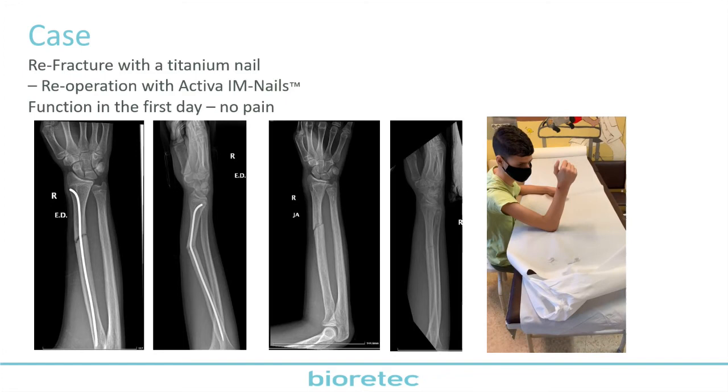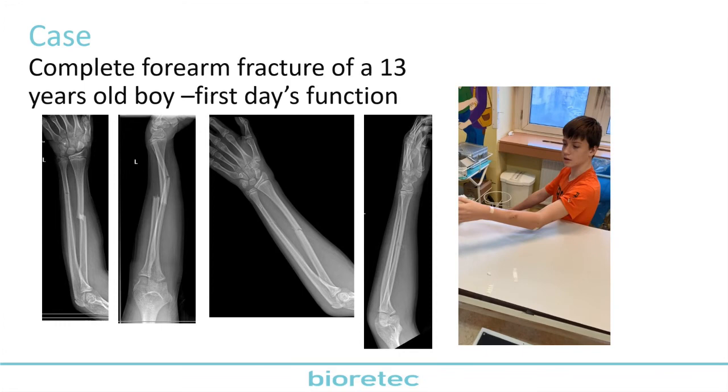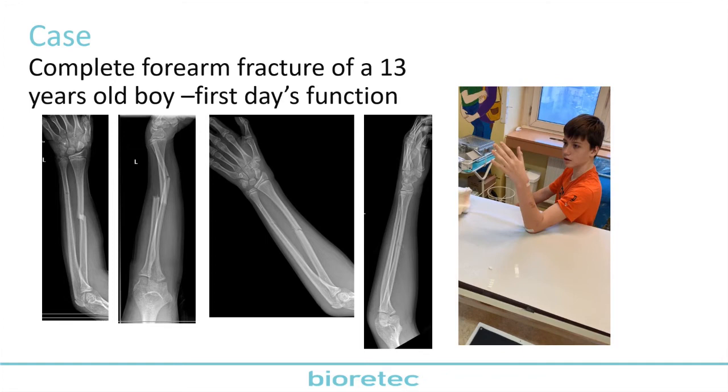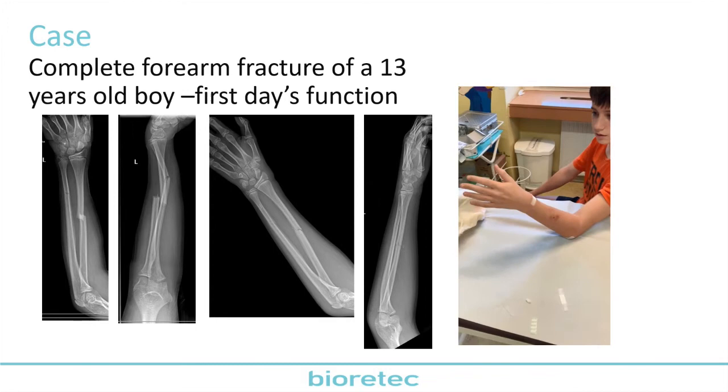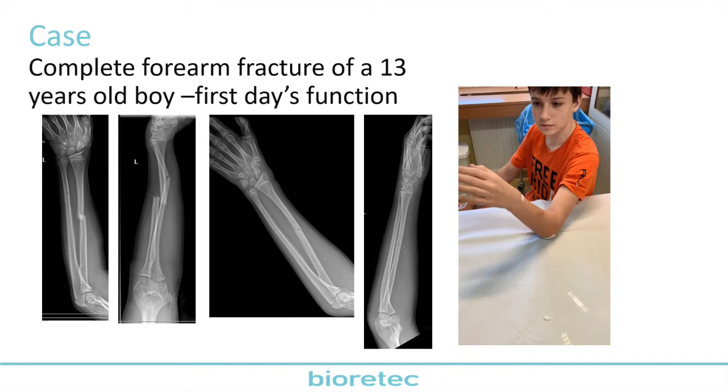Here's a complete forearm fracture with a very stable osteosynthesis. Again, the thickest IM nails were put inside, and this boy was able to move his forearm without any pain after 24 hours. Of course, in his case, we gave him an above-the-elbow plaster cast, as the recommendation is, but I hope that in the future the immobilization time will be reduced dramatically, even with IM nails.